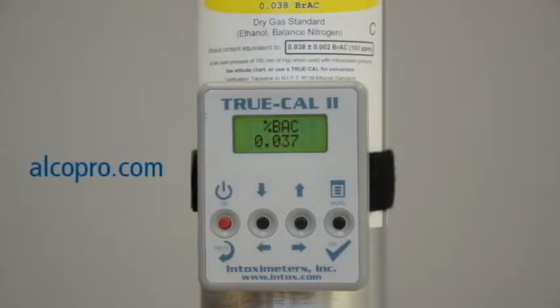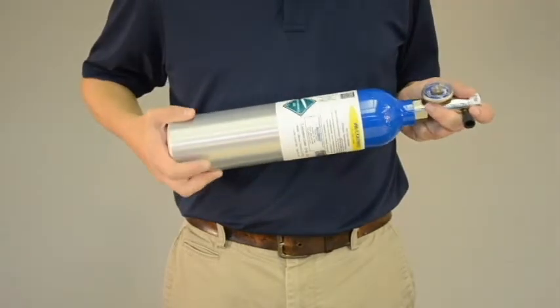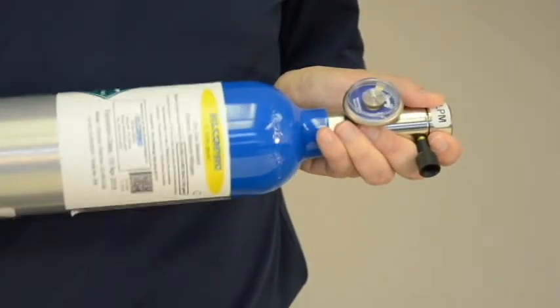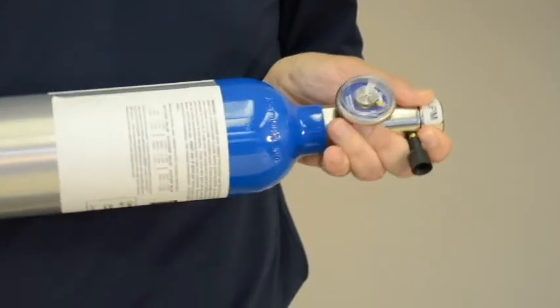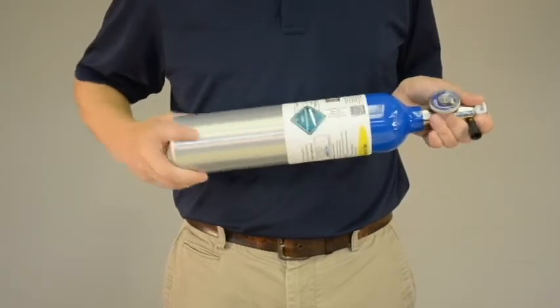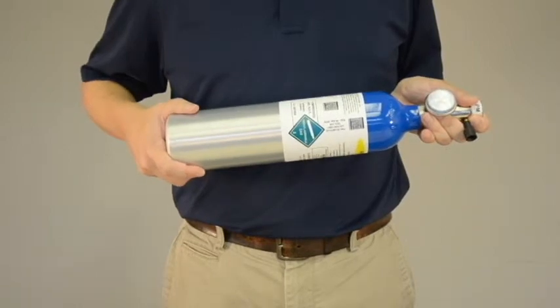Now that you know your expected gas value, you can proceed with the accuracy check. First, attach the regulator to the dry gas tank. For safety purposes, point the regulator end of the canister away from your body and away from others. Twist the regulator securely in place, making sure you don't over-tighten. You may hear a pop or hiss sound as you tighten the regulator — this is normal.